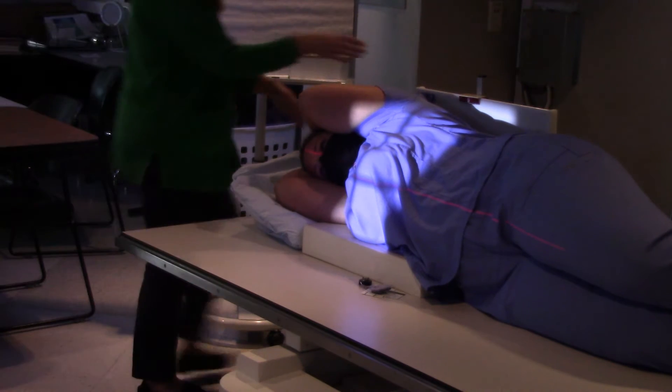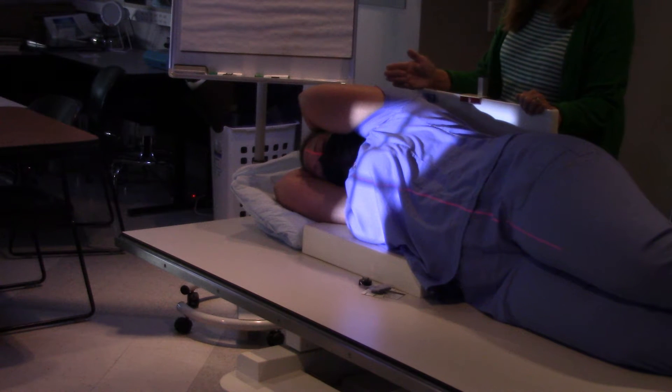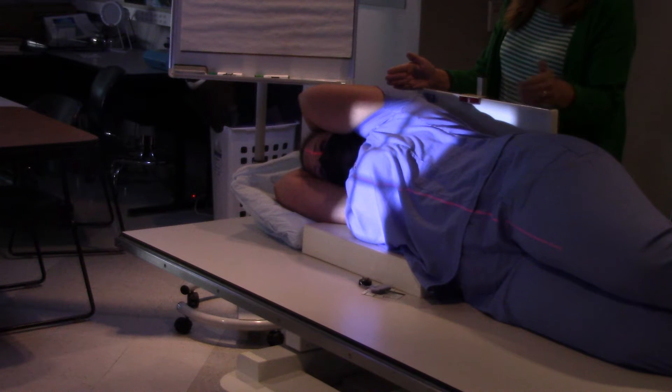Think about this — are you happy with the top of your board? The top of your board is at the top of the shoulders. Is your central ray in relationship to mid-chest? So do you move your centering point down to match mid?